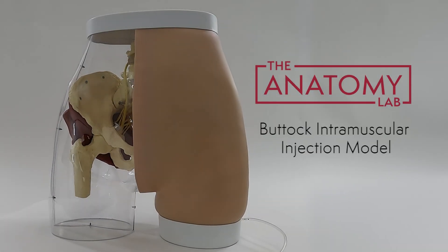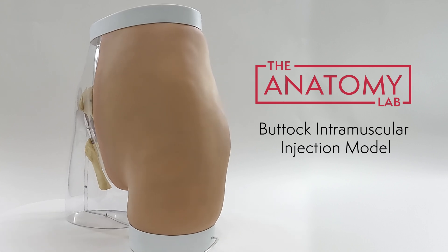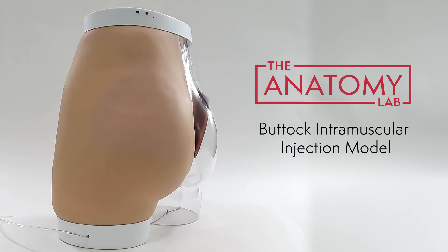This is the Anatomy Lab Buttock Intramuscular Injection Model, a responsive medical simulation device that allows students to practice proper injection skills on the gluteus and receive real-time feedback in their training.